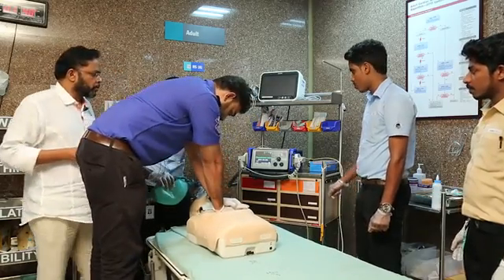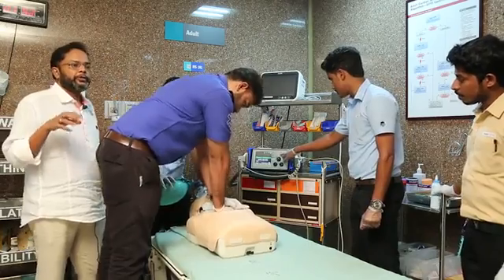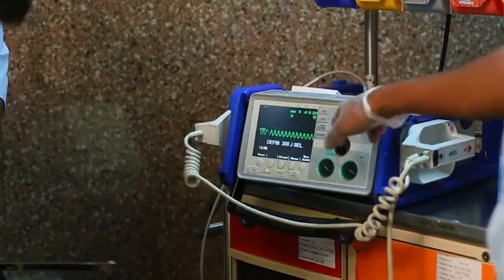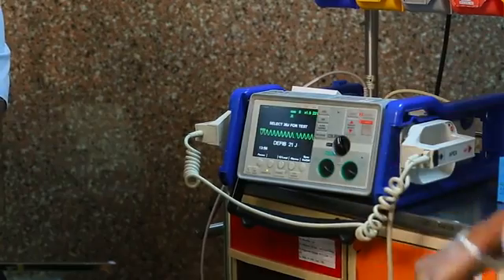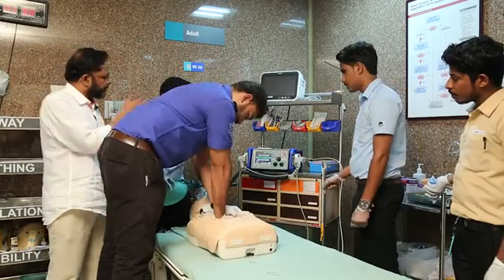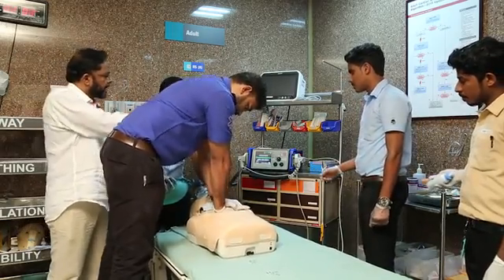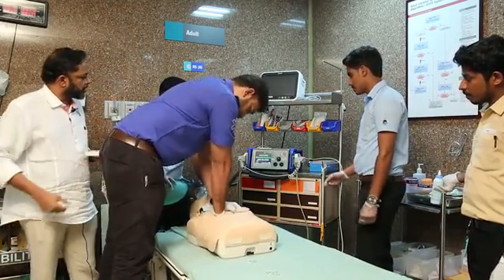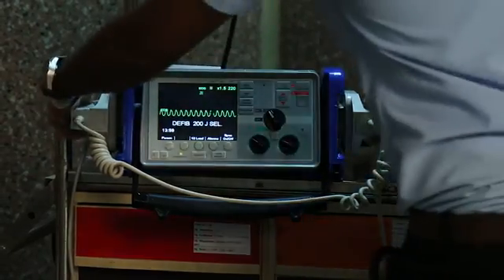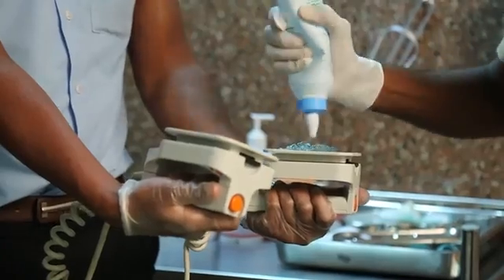My colleague is going to demonstrate how defibrillation is done. First, he has to charge to maximum energy. In a situation of defibrillation and cardiac arrest, you have to charge the maximum energy available on the defibrillator. This is a biphasic defibrillator and he charges it to 200 joules.